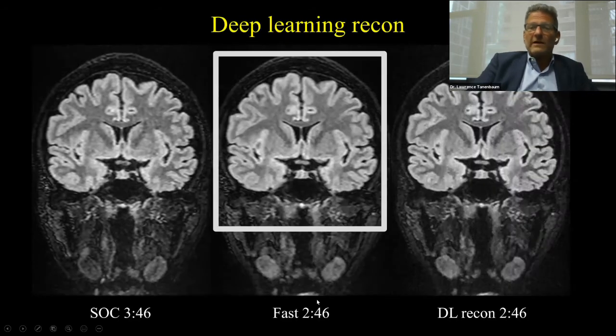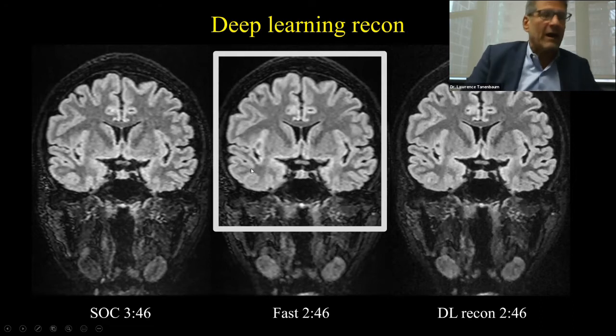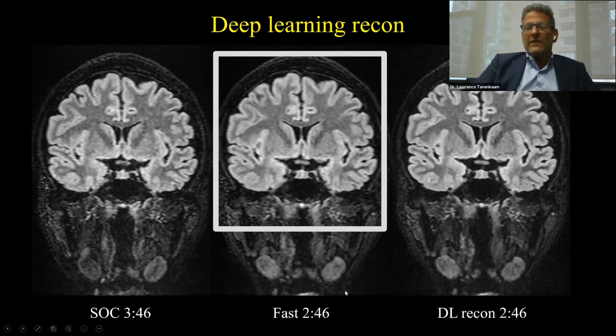That's with 2D FLAIR. I don't know which one of our sites this is from, but it is from one of our sites where, again, we took a 3D FLAIR, a little noisy but kind of long, and we managed the noise and improved the speed and went to here. But you see, still, we gave up some of our spatial resolution, which can really have deleterious effects on reformat image quality. Notice how we use deep learning to restore that image quality, but still keep the faster scan time, which I think is entirely cool.